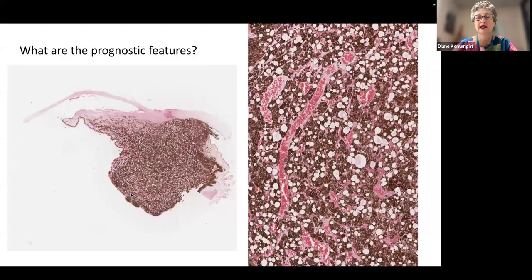All right, so here's another pigmented thing. This is another trick. Here we have the cornea. It's looking a bit raggedy, and we've got the iris and ciliary body, and here we've got a pigmented tumor. So this is a pigmented tumor arising from the pigmented epithelium of the iris and ciliary body. We would have to know how it was behaving and do some more tests on it to determine whether this was a pigmented epithelial adenoma or carcinoma. But another tumor that's pigmented, that is not a melanoma.